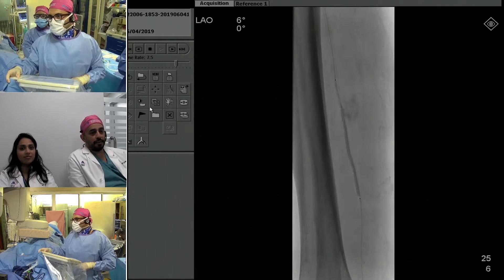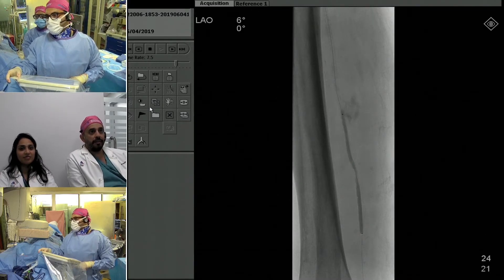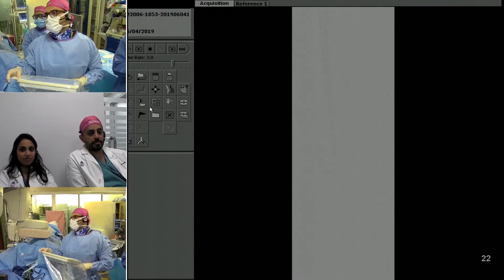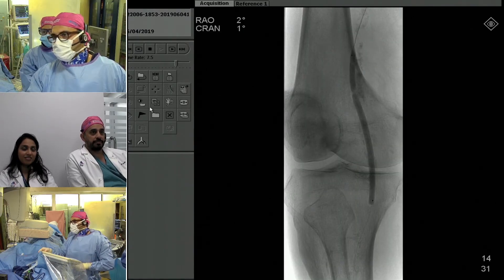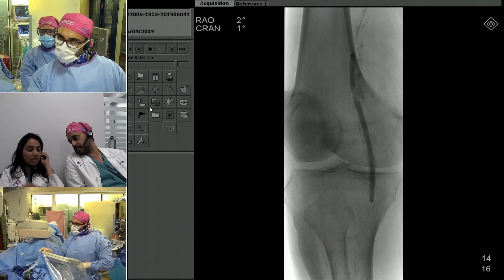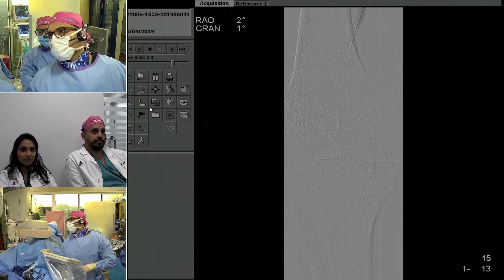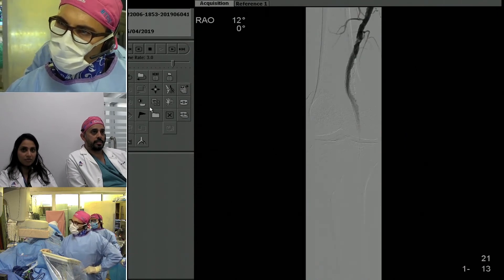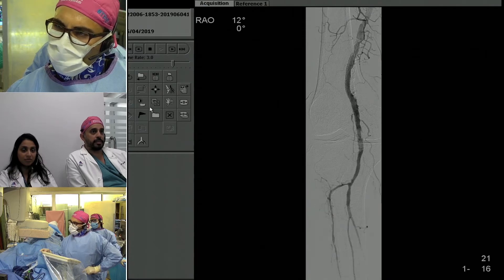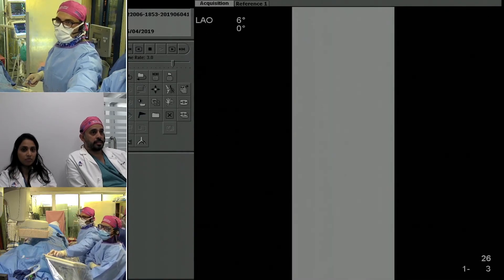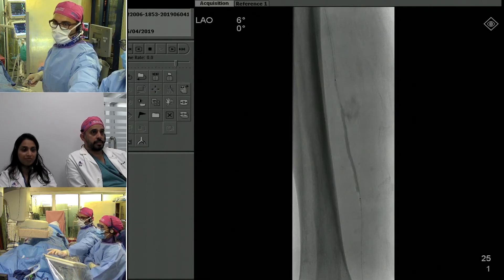This shows us initially ballooning the tibial on a 200-centimeter length rapid exchange balloon. Here is our initial angioplasty with a 5-millimeter by 120 balloon, and this is the angiogram afterwards. We actually kept this completely radial. I would open up the outflow — at least one, preferably two vessels — if I opened up the popliteal occlusion. This looks great; that posterior tib is a juicy vessel with good outflow.